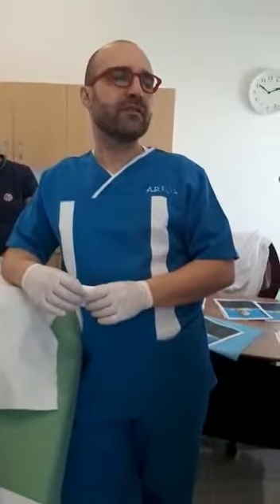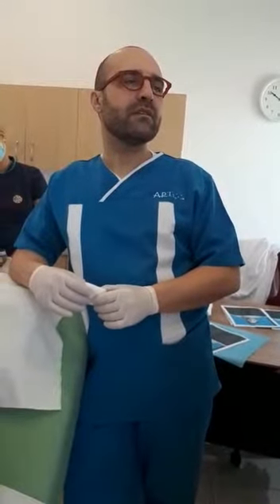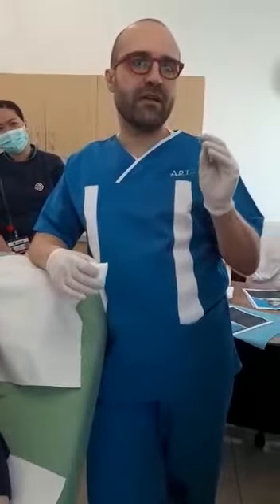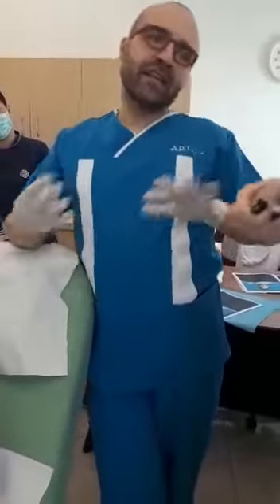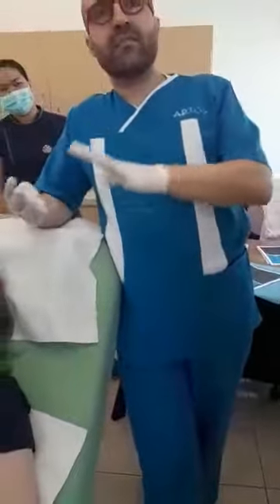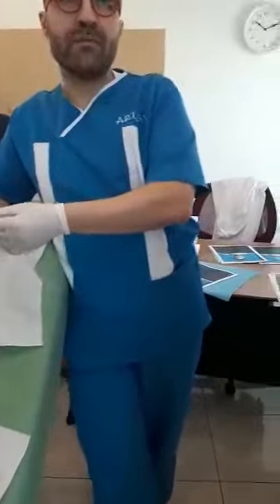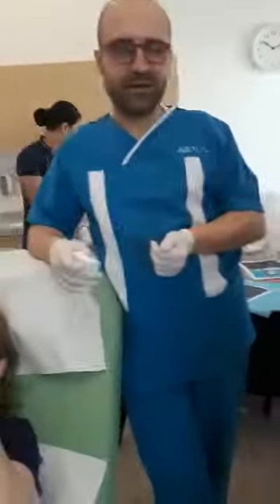Why most of my patients told me that they did threads before and nothing happened within 1-2 months. Probably it's a problem about the material, the PDO threads, or the technique. Material and technique. Technique is something that Aptos conceived for the thread, and I'm going to show you. Material is a general problem.